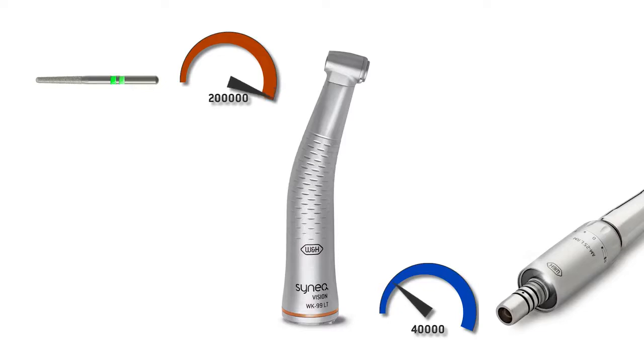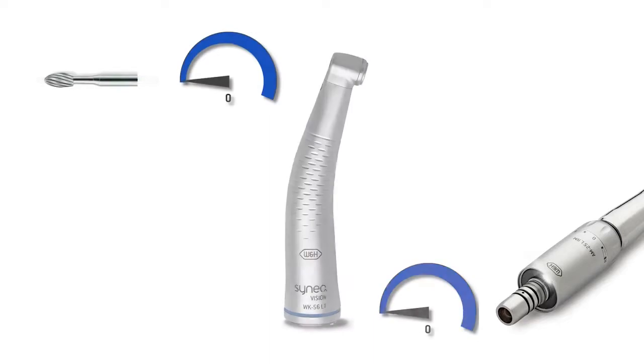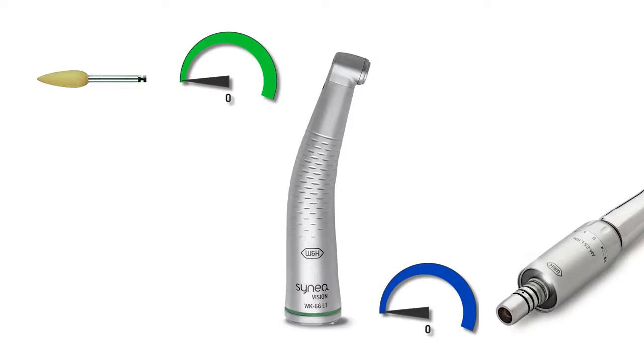Red contra-angle handpieces operate faster than the drive speed. This means that the operating speed of the rotary instrument is higher than the motor speed. Blue straight and contra-angle handpieces transfer the motor speed 1:1. And green contra-angle handpieces operate slower than the motor speed. This means that the operating speed is lower than the drive speed.